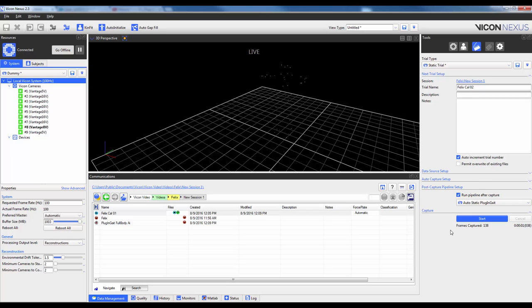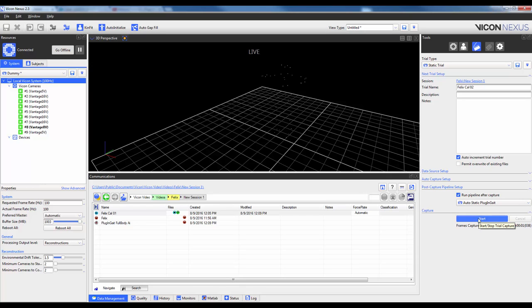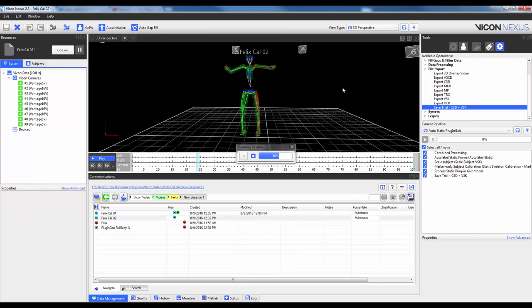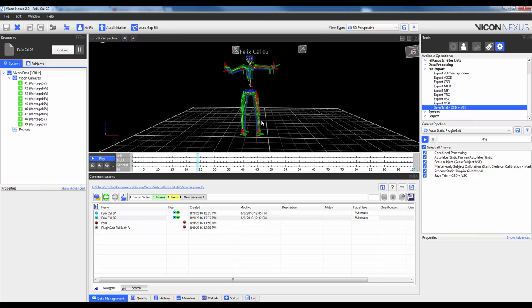So now when I click start, it should automatically run through and do everything for me. So I'm going to go ahead and save this trial type first so that it runs this every single time. And I'm going to go ahead and click start. You'll see that it captured the data, it's taken me offline, it's provided a different name for the trial, and it's actually processed and calibrated everything for me. Again, you will want to make sure that you can get reliable captures for your static trial before wanting to automate the process this much.